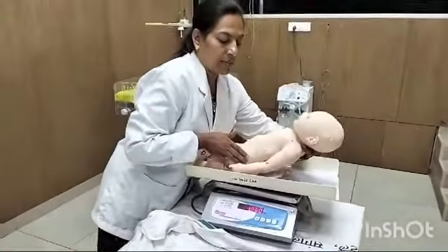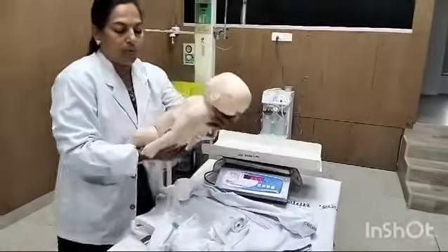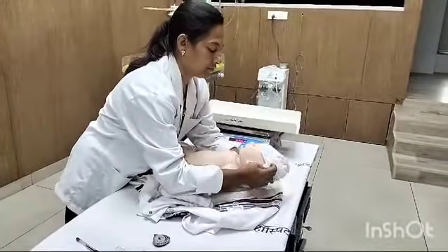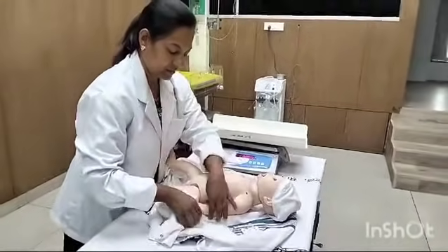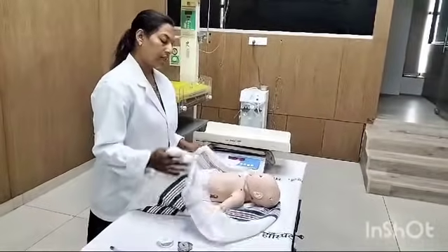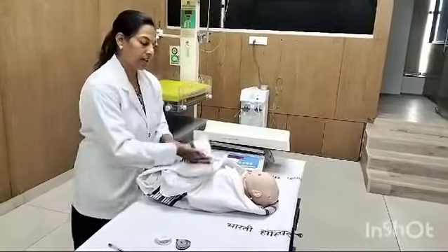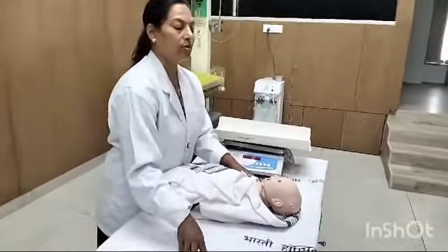Now we need to take the baby again and cover the baby properly. We need to cover the baby's other parts so we will not get hypothermia. Now here we need to take the anthropometric measurements.